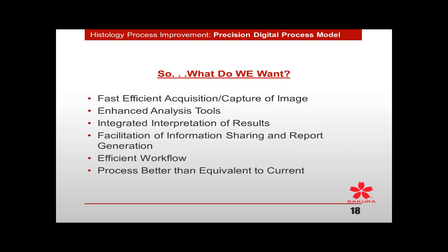So what do we want? I can tell you from my point of view, I want fast, efficient acquisition and capture of the image. It just has to be there. You have to have an efficient process there with the digital scanner. We all want enhanced analysis tools. We want more algorithms that are going to help the pathologist make decisions and reinforce the pathologist's decisions. You want an integrated interpretation of the results, facilitation of information sharing and report generation.